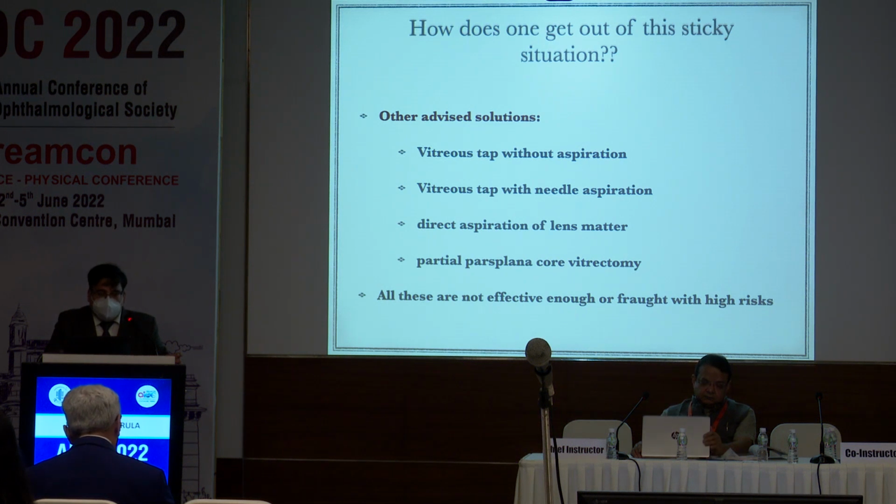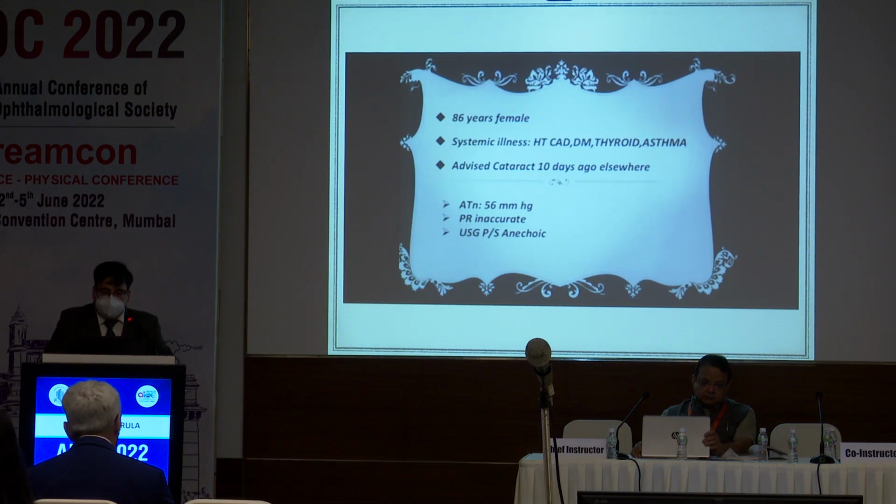But all these procedures done blind are fraught with a lot of risk. There is a risk of complications, retinal detachment, vitreous pull. All these can lead to a lot of tricky situations. So we came up with this technique.